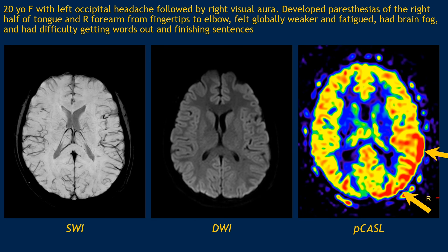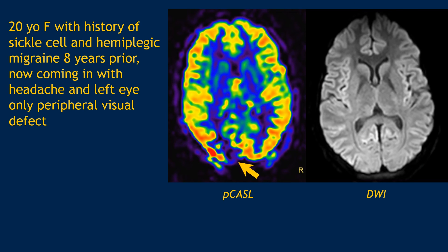This is another example of a young 20-year-old female with occipital headache and visual aura. Everything on conventional imaging was normal, but perfusion images on ASL showed that the left temporal occipital region was elevated in perfusion flow. Another patient with sickle cell also had auras, and there was decreased perfusion in the right occipital lobe, probably explaining her visual deficits at that time. This is also probably hemiplegic migraine.